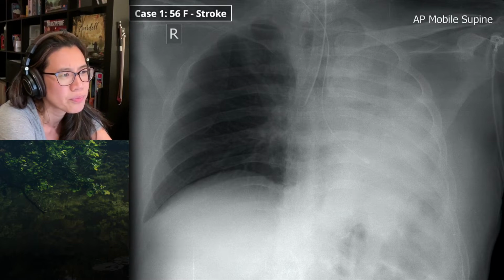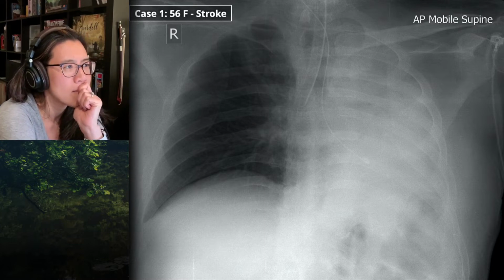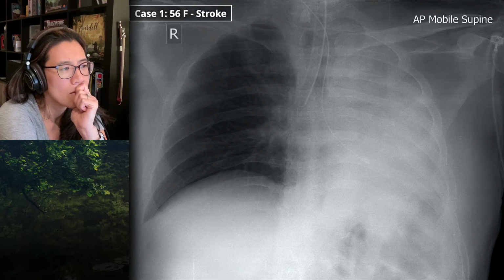orifice. Right, let's take the tube. So the important thing is it's a white hemithorax, which is small. Note the gas under the left hemidiaphragm is probably as high as the right diaphragm. The left ribs are crowded. The mediastinum's shifted to the left. So there's significant volume loss and you've got an opaque hemithorax.